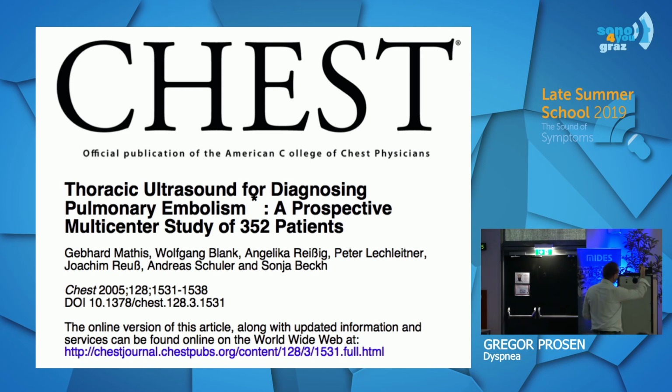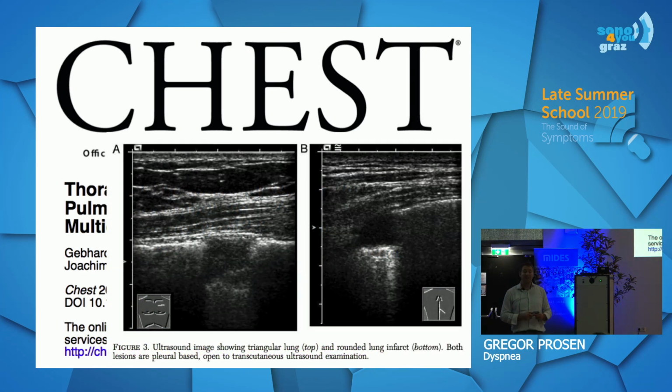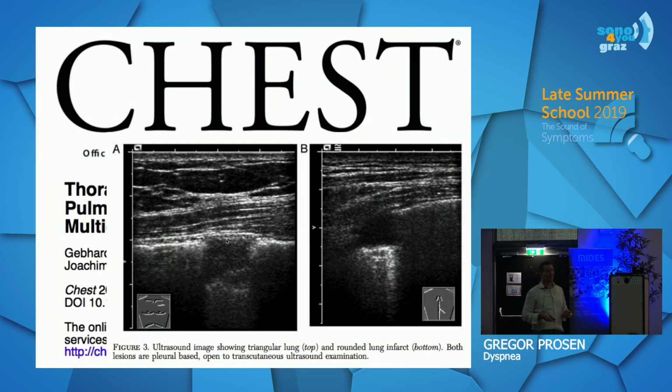One more thing, Austrian colleague from Tyrol, he also found out that pulmonary infarctions with pulmonary embolism, they produce very little small anechogenic atelectasis. But in this case, you really have to go in each intercostal space, scanning and trying to find such pulmonary infarction, just to show you. Otherwise, you cannot really see pulmonary embolism.